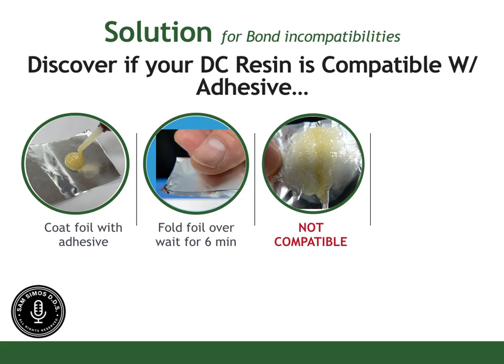If I take the tinfoil apart and I see that there's some squishiness in the material, or I see that on the surface between the foil it sometimes looks gooey. Sometimes it'll be just sticky. Then I know it's not compatible.